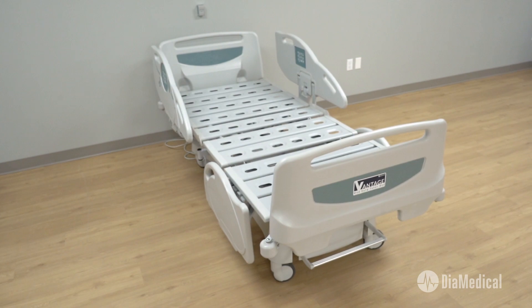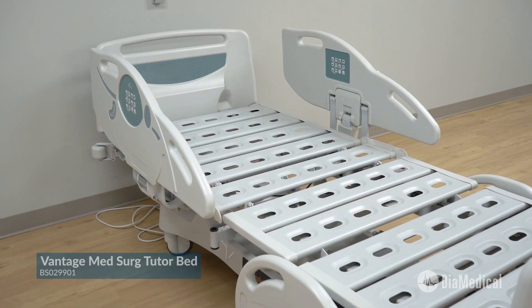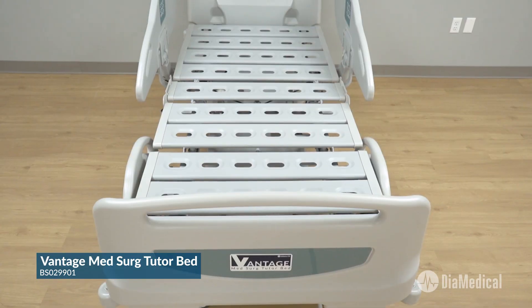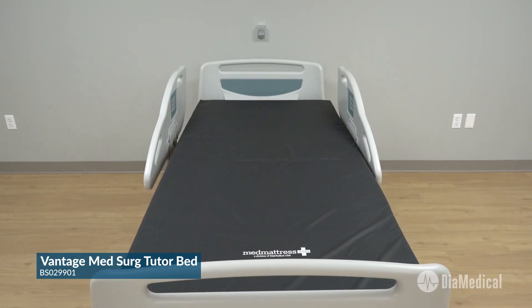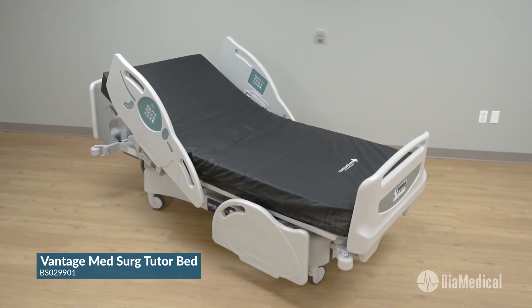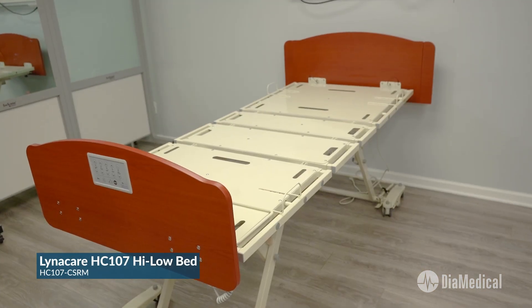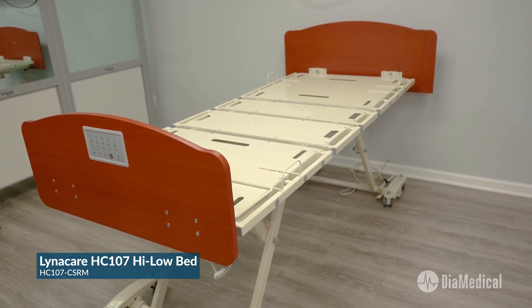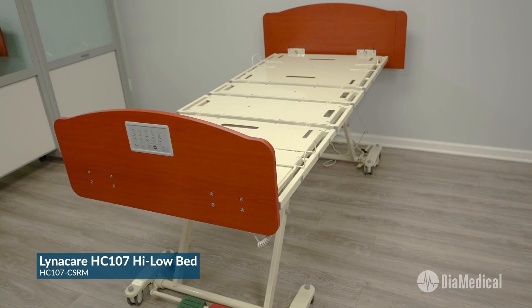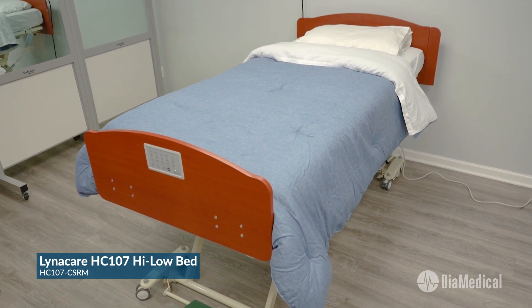The Vantage Med-Surg Tutor Bed and the Linecare HC-107 High-Low Bed. The Vantage Med-Surg Tutor Bed is an acute care bed designed for skills practice, validations, and simulations in healthcare education, ideally suited for nursing programs that prepare students to work in hospital environments. The Linecare HC-107 High-Low Bed is a great option for LPN and nursing assistant programs to prepare students for long-term care including skilled nursing facilities, assisted living, and home care. It is also the most cost-effective bed for programs with a limited budget.